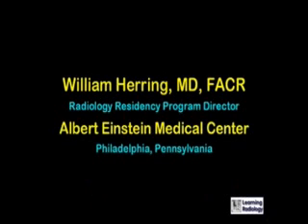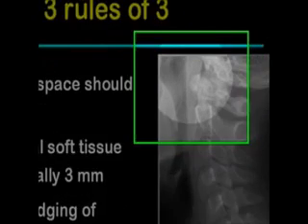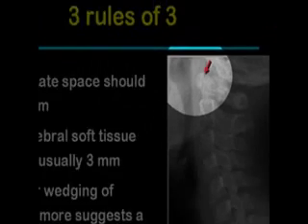Cervical spine trauma — I'm William Herring from Albert Einstein Medical Center in Philadelphia. First we're going to start with some normal anatomy. These are my three rules of three. The predentate space, indicated by the red arrow pointing to the thin lucency just in front of the dens, should be less than three millimeters in an adult.